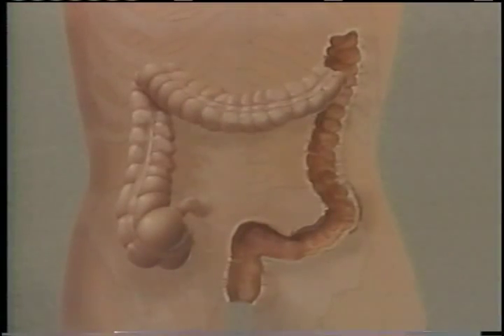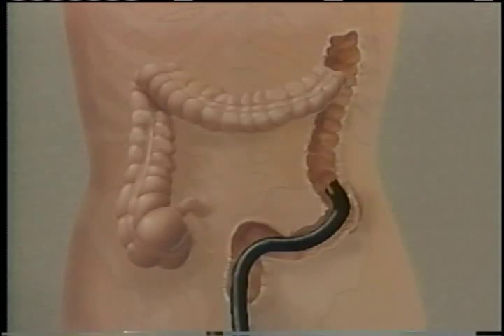With precise movements, your doctor will guide the scope into your rectum, around the curves of your bowel to the lower left end of the colon, examining the lower GI tract's lining. The procedure may cause some discomfort. Although the sigmoidoscope is well lubricated, some discomfort may be experienced when it's inserted and navigated through your intestine's curves. You may experience gas or cramping as air is used to inflate certain areas for a better view. Sigmoidoscopy is a short procedure, and sedation or medications are normally unnecessary. Your doctor will further discuss with you if he believes medication is needed.